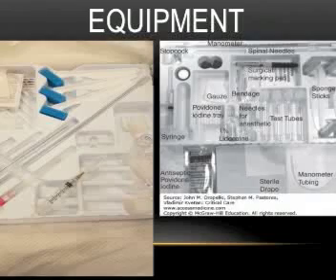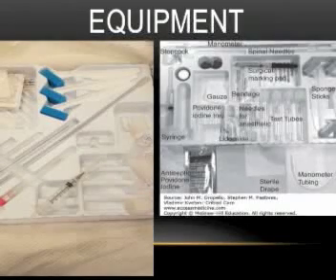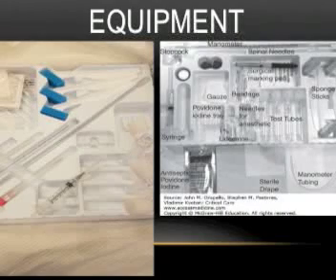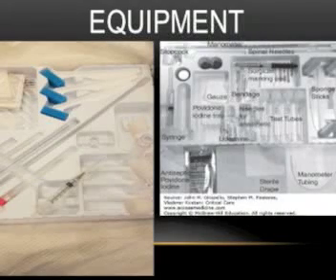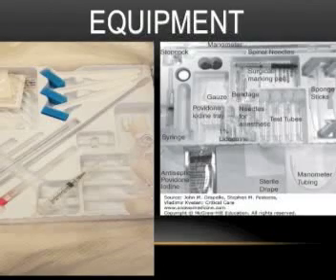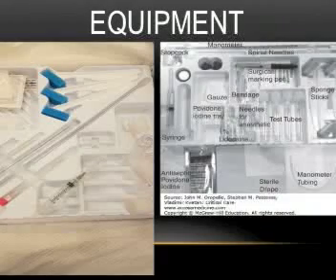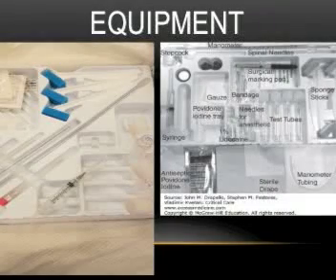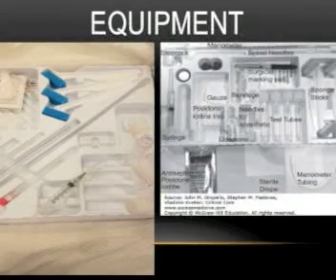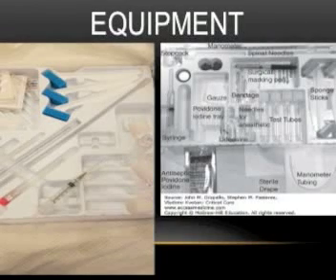A lumbar puncture is typically done between the L3, L4 or L4, L5 interspace. It is important to have the patient sitting with spine flexed or lying left lateral decubitus with knees drawn towards the chest, again flexing the spine. This helps create more space for your needle entrance into the subarachnoid space. It is important, before putting on sterile gloves, to locate L4. You can do this by finding the iliac crest, which will be even with L4.